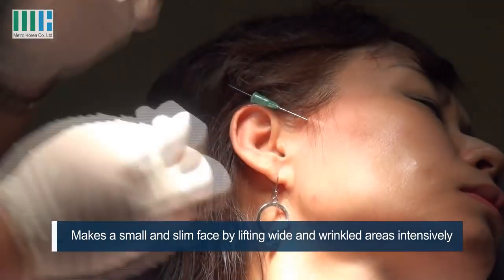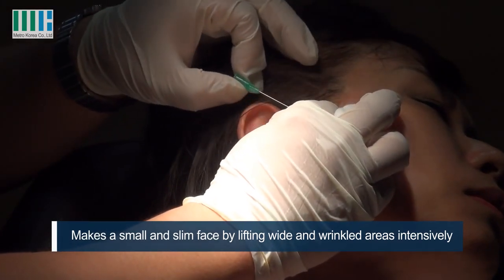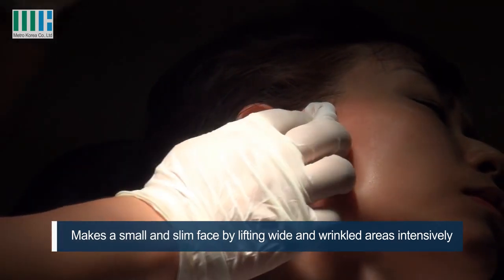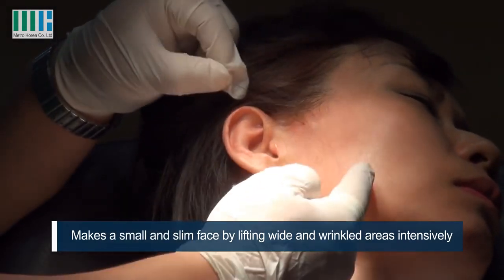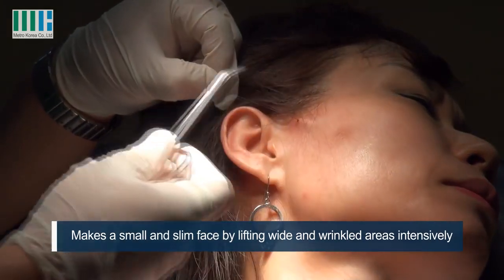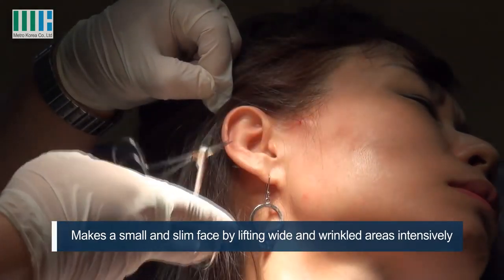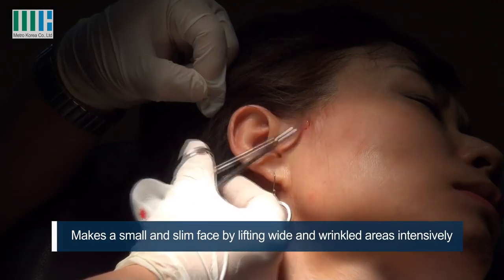See here? It is hooked in this area. When we pull, this time in this right direction, it was about this.